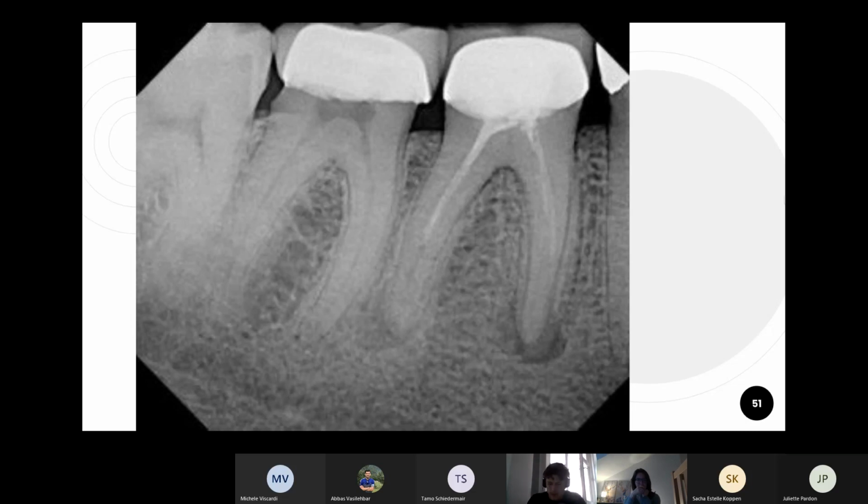All right, so another periapical projection. A good example for a case where it's not enough just to say it's endodontically treated. You have to tell the teacher, or even in practice, you should know for yourself and for your treatment plan how it is endodontically treated. And in this case, it's not very good. You can see it's not homogeneous.